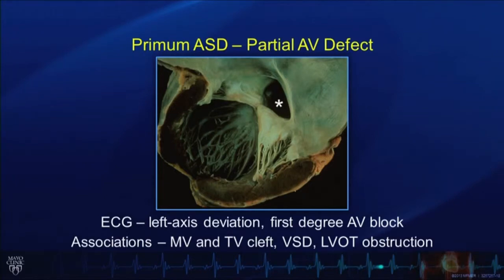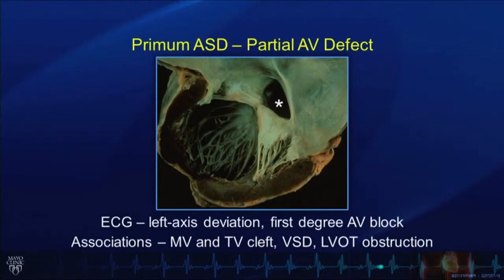We're looking here at the heart from the left side. Left atrium on the right side of the screen, left ventricle on the left side of the screen. An important finding demonstrated here is a cleft in the anterior mitral leaflet. Primum atrial septal defect and cleft mitral valve often go hand in hand. We also want to look for an abnormality of the tricuspid valve, because this defect is very close to the atrioventricular valves, where the AV valves are frequently abnormal.